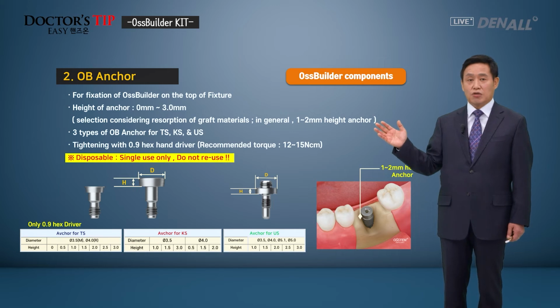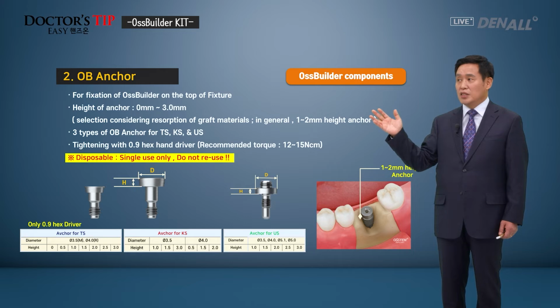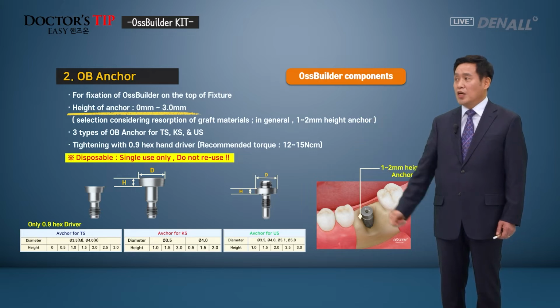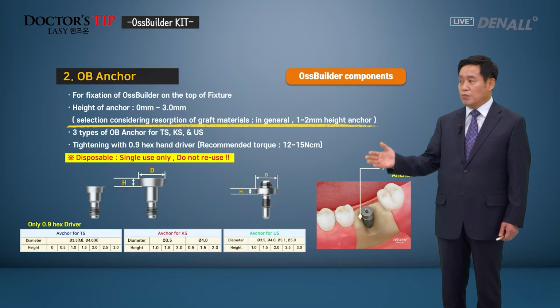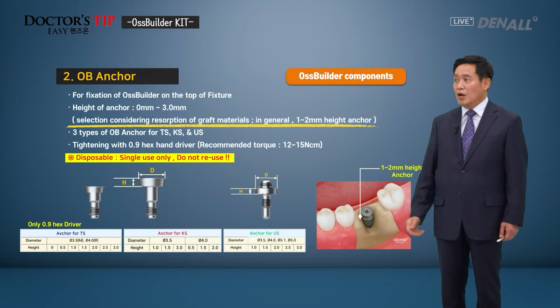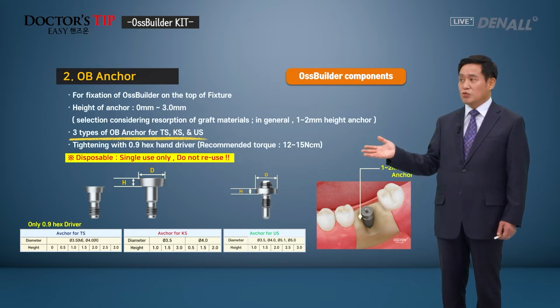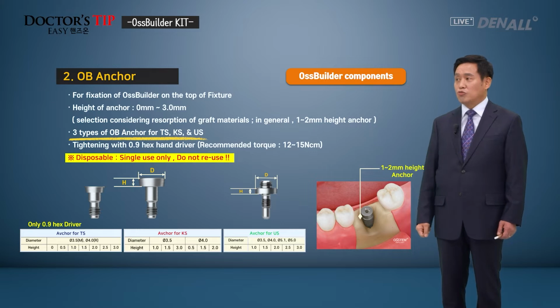Next, OssBuilder component. In order to connect OssBuilder on fixture top, you need an anchor for that. The height of the anchor, basically, is from 0 to 3 millimeters. When you choose your implant for the defect, you anticipate that there will be bone resorption on the top. You need to factor that in and do graft sufficiently. In my case, I normally choose an anchor height of 1 millimeter, and this OB anchor can be divided into 3 different types: TS, KS, and US.